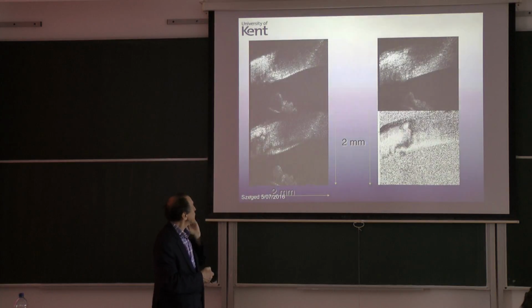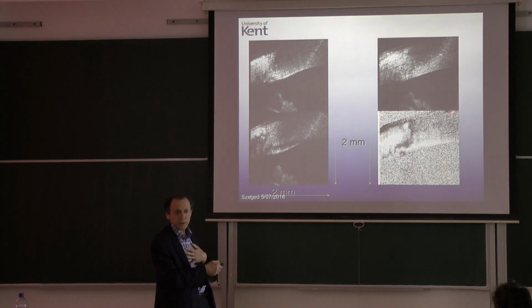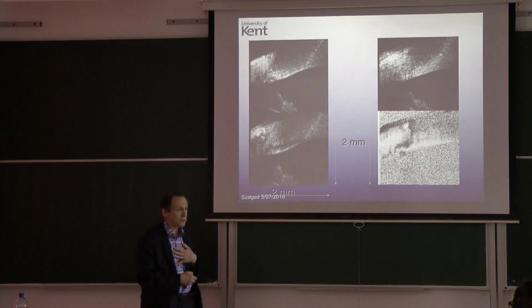And in the cornea, look at two images from the cornea, from the extreme lateral part. You don't see too much difference between H and V. If you combine them, you get the polarization insensitive image, but when you produce the birefringence, look how exquisitely different this is. It shows you the junction between the cornea and sclera, here. See? The junction here, which we barely could identify. The birefringence image will show. That is due to the collagenous links in the sclera.